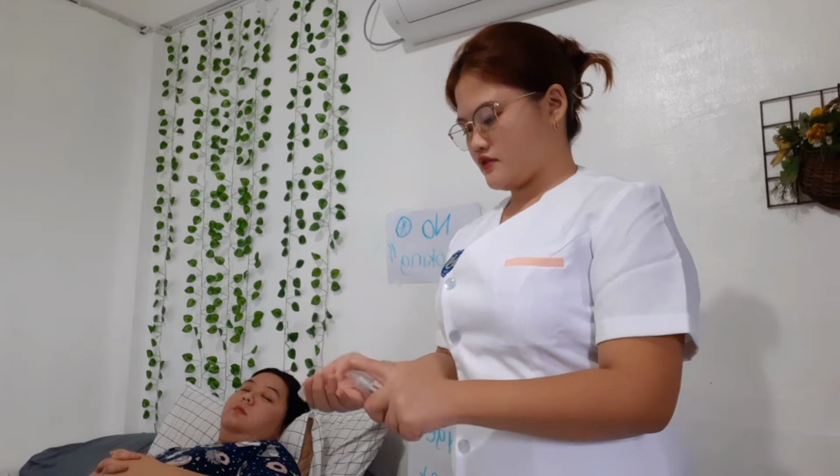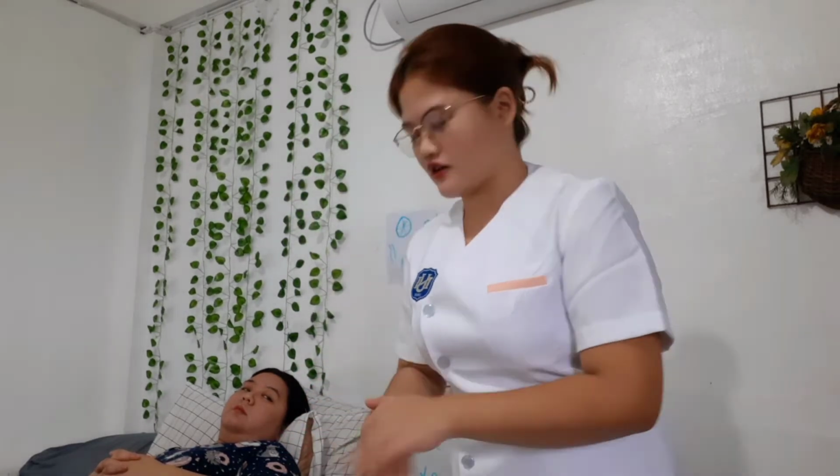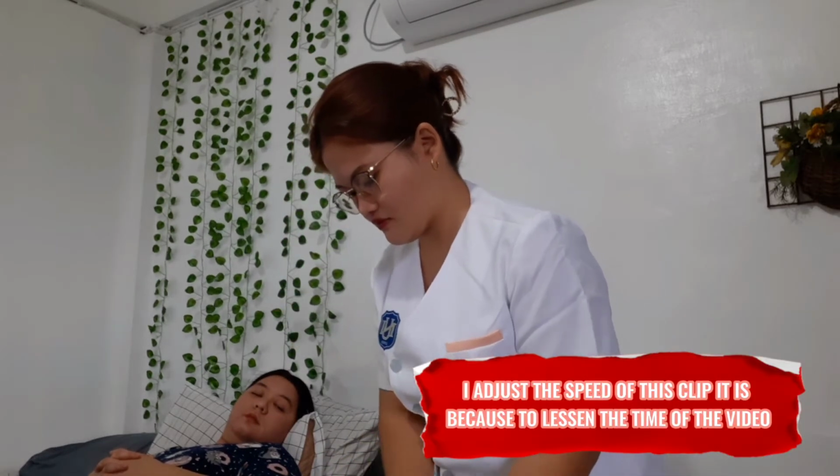So before proceeding to the implementation, you need to do hand washing first and also don gloves. What is the rationale for that? It is to deter the spread of microorganisms and to avoid contamination from patient secretions. So I will wash my hands and I will be back. After washing my hands, of course, I will use ethyl alcohol 70%. And I will don the gloves. I adjusted the speed of this clip in order to lessen the time of the video.